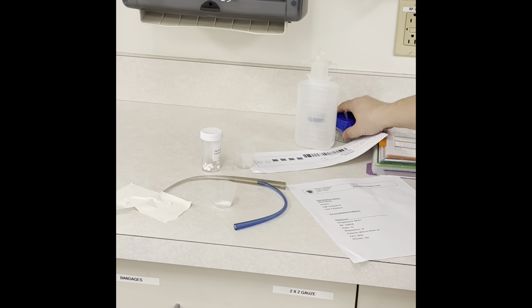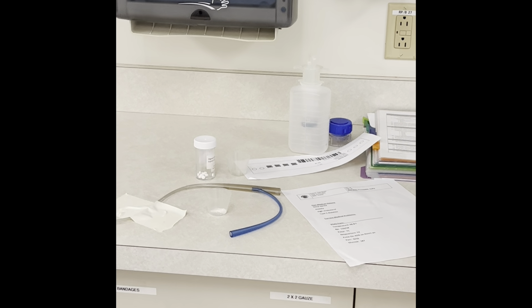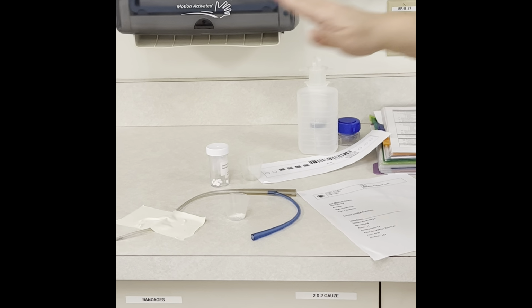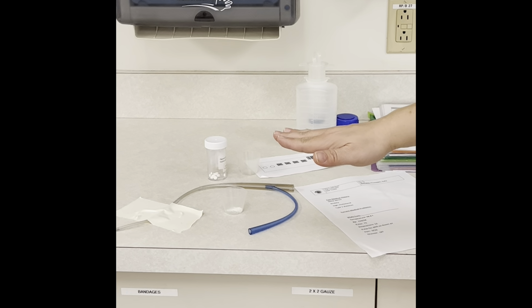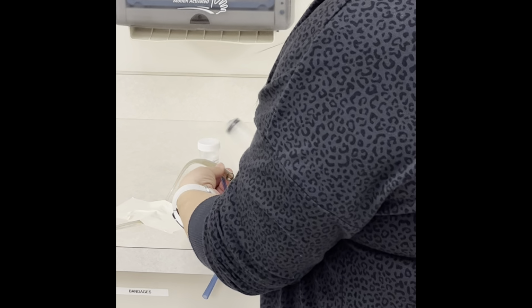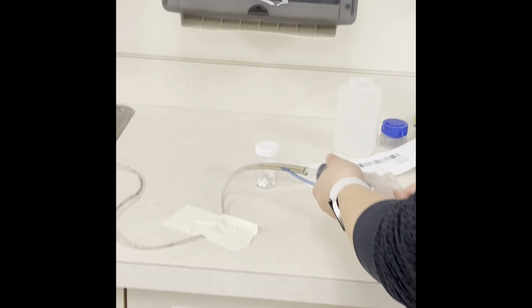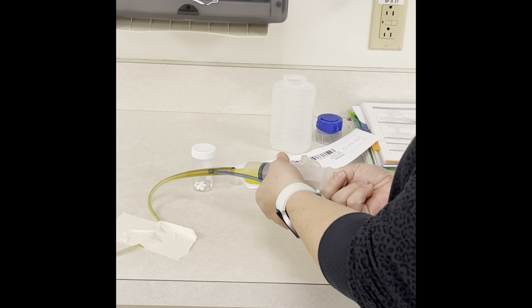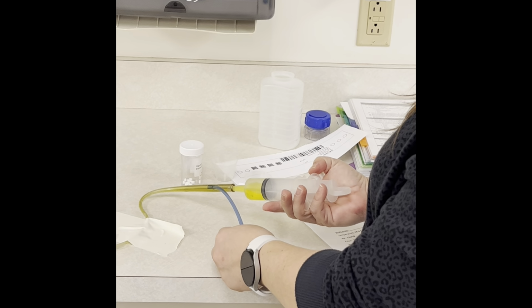Now we wanna make sure our patient is, again, up in that high Fowler's. We wanna make sure that they're completely up. And towels over their chest. We need to verify that the tube is in the correct spot. So we're gonna take our 60cc syringe. We're gonna attach it to the clear end. And we're gonna pull back. So this time you guys actually get contents. Our 10 to 20 of fluid.